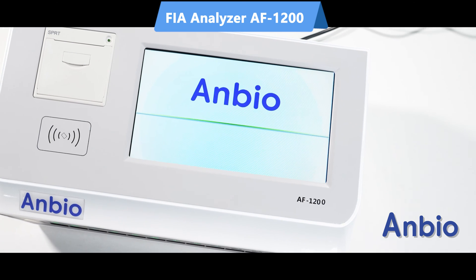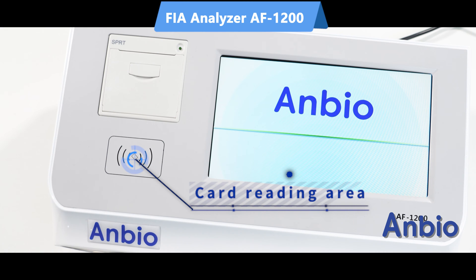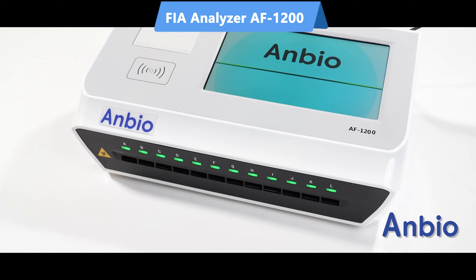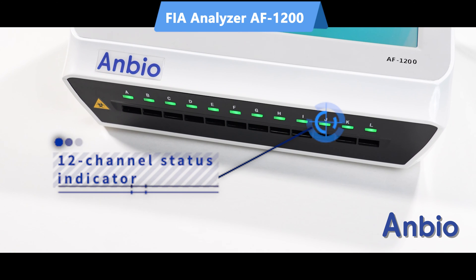The analyzer includes a built-in thermal printer with real-time printing of results, and is capable of storing over 20,000 test cases for comprehensive record-keeping, while delivering rapid results with a test speed of up to 240 tests per hour and continuous sample feeding.